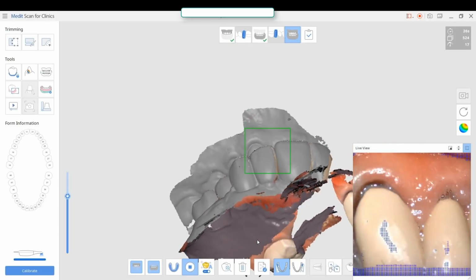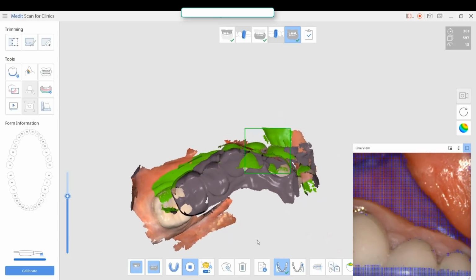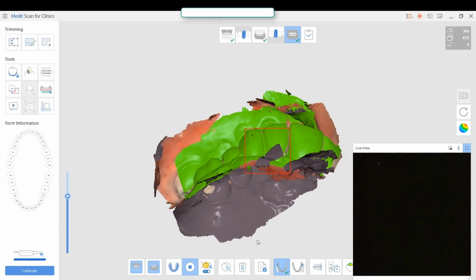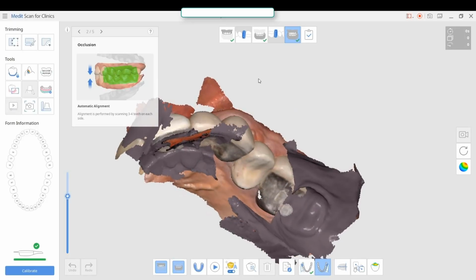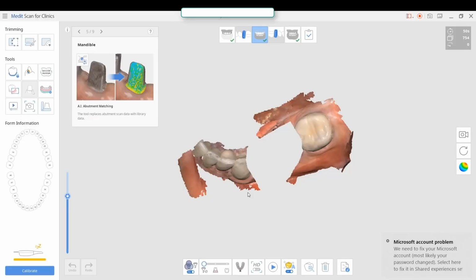We're going to have the patient open their mouth, and then we're going to roll over to the buccal and even the occlusal surface of those teeth. And now we've incorporated a lot more data. This deep overbite was hiding that tooth structure. So with this advanced technique, we're able to capture the bite in this situation where the upper jaw was hiding the lower jaw. So now the stage is set for the modification of the preps and the imaging of the two refined preparations.